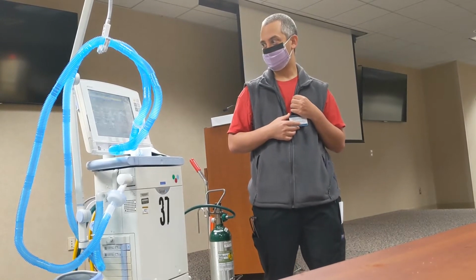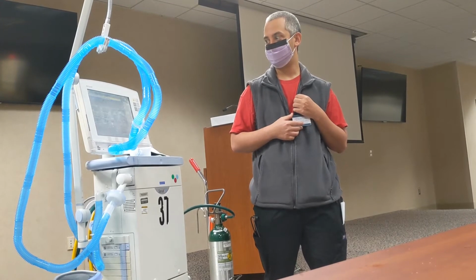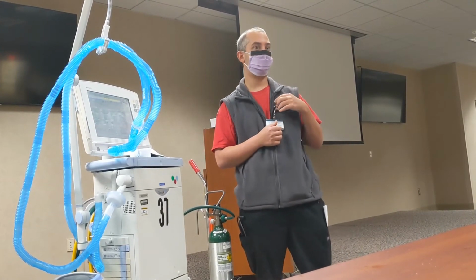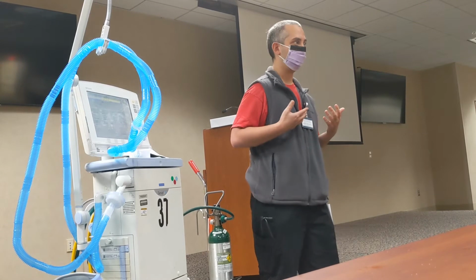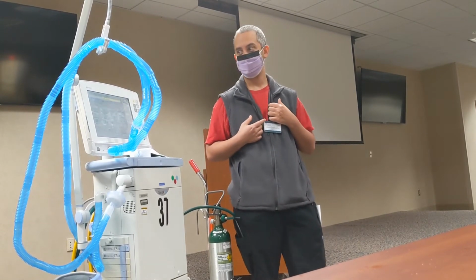All right, and then kind of jumping around a little bit. So with your P high, that is the pressure you're setting to try and recruit the patient up, which is essentially what you're trying to do with this.